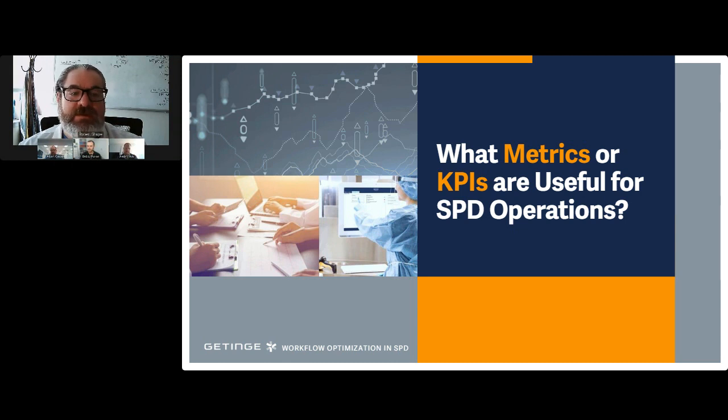Three times a day, we send out a report that says how much work is not sterile, still sitting in our queue. And then we link that back to the case, because we're not trying to get to zero every day. We're trying to make sure everything that's needed for the next day is ready and the emergency items are ready, and balancing that in a way that we don't go over a threshold that puts us far behind our ability to recover. Yeah, and that stress factor.